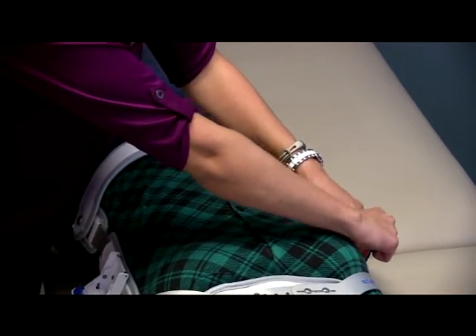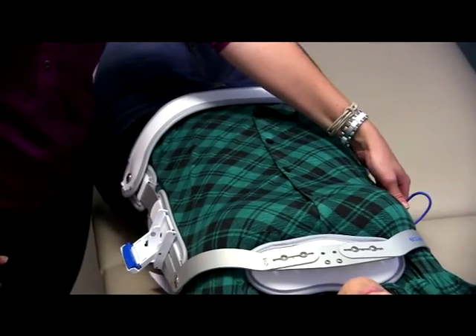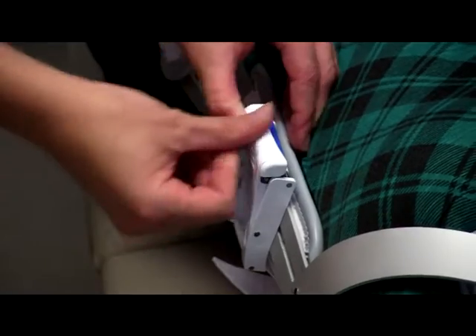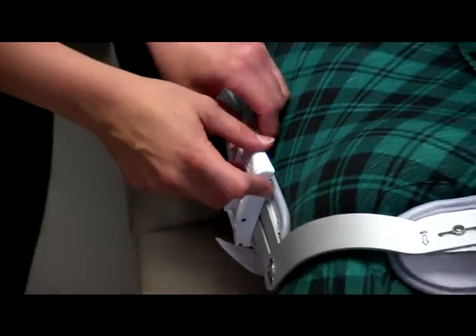We're going to pull on the blue string to get the plastic piece over top of that raised screw. Once you get it over top, it should snap into place — make sure that you feel it snap backwards to lock it in. Then we can come over here and pull on the strap to close the box. Make sure you hear it snap into place to confirm it's locked.